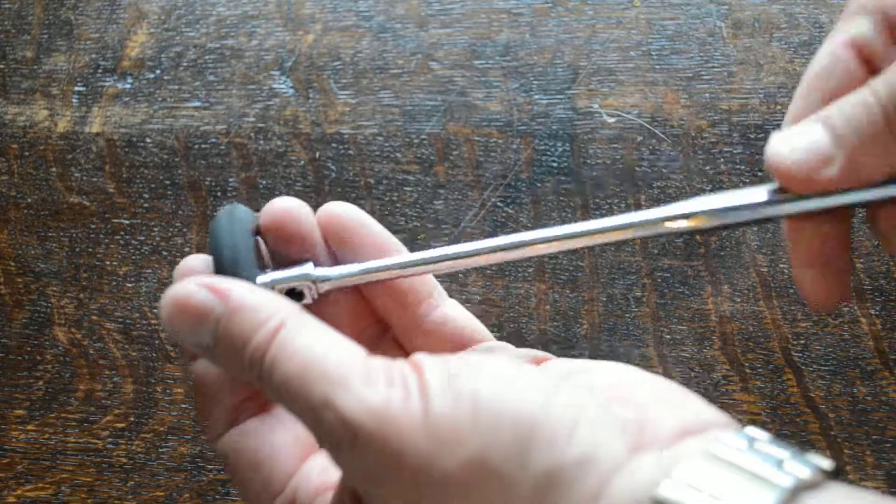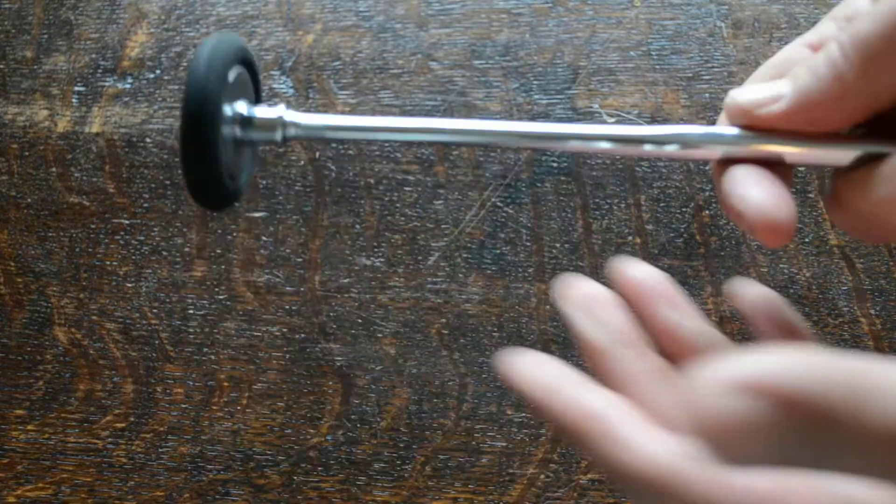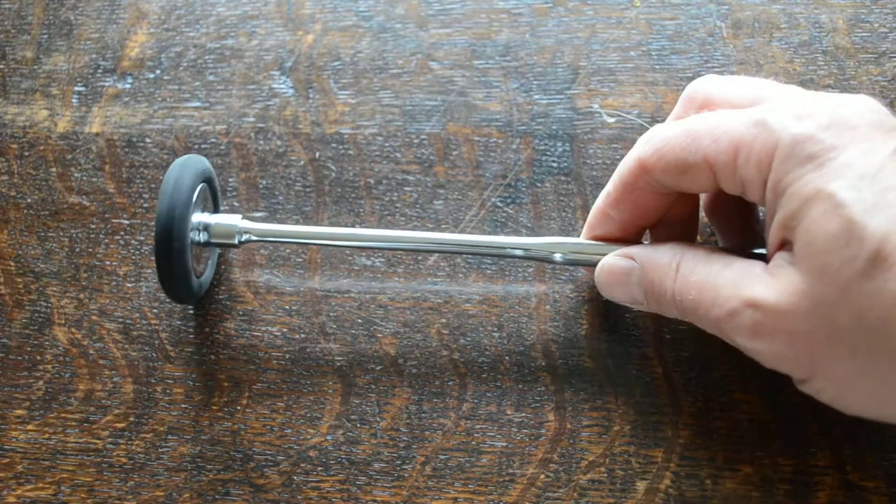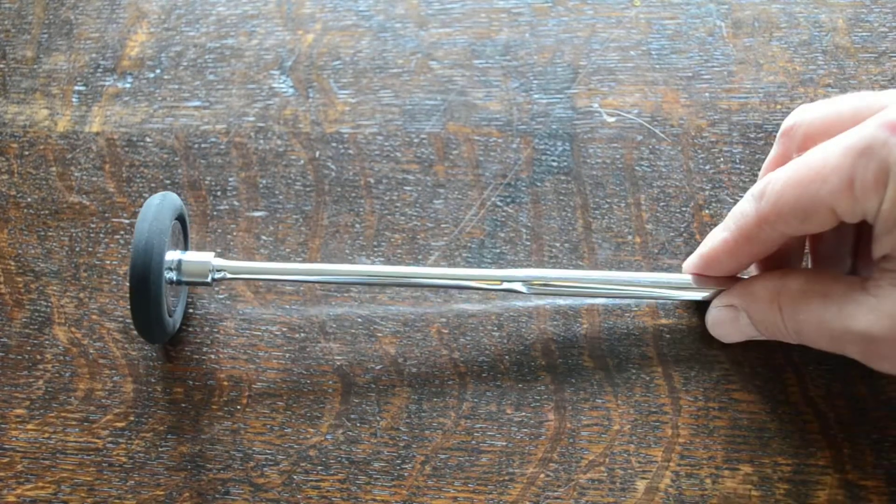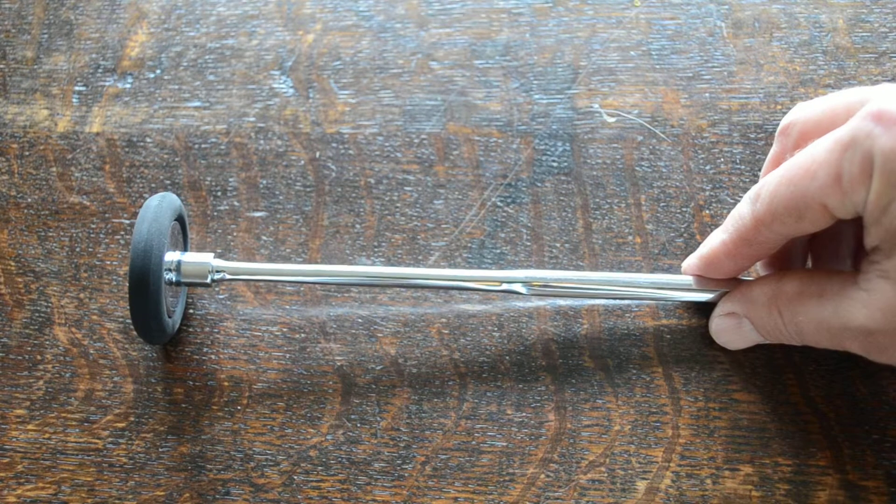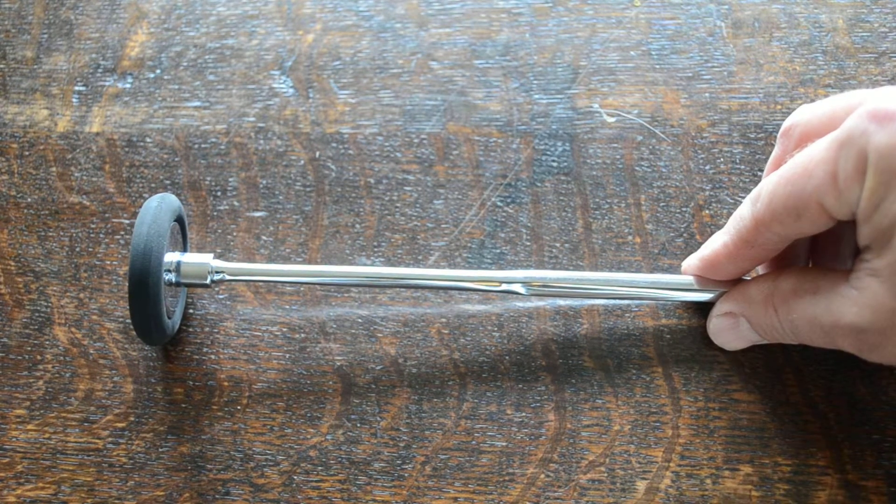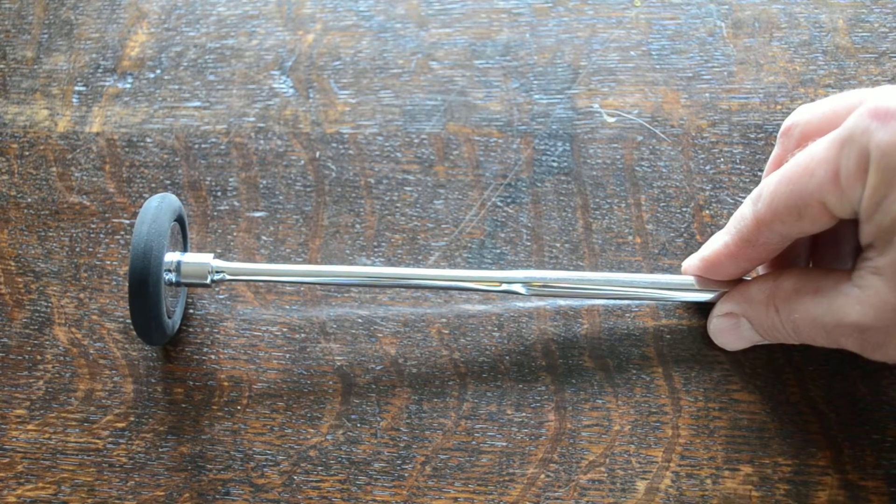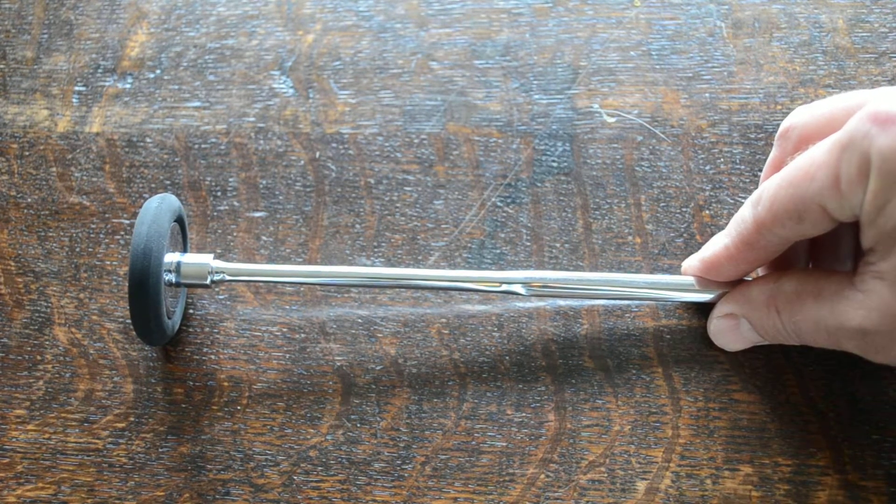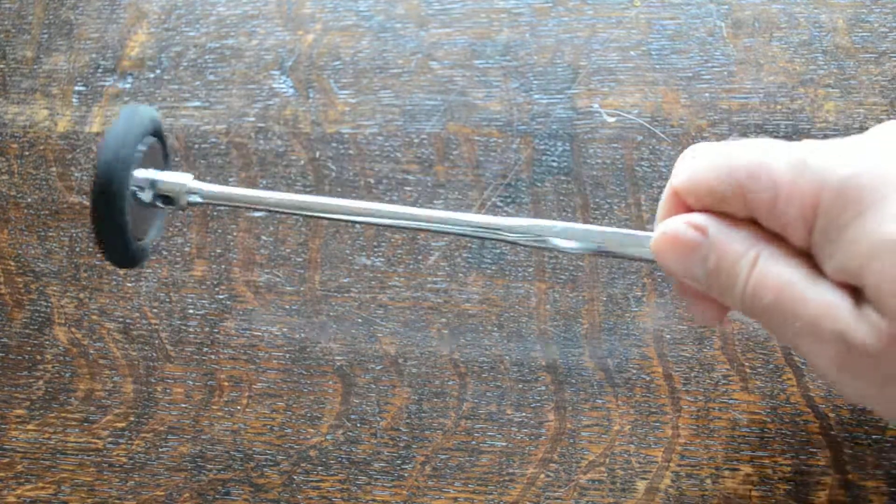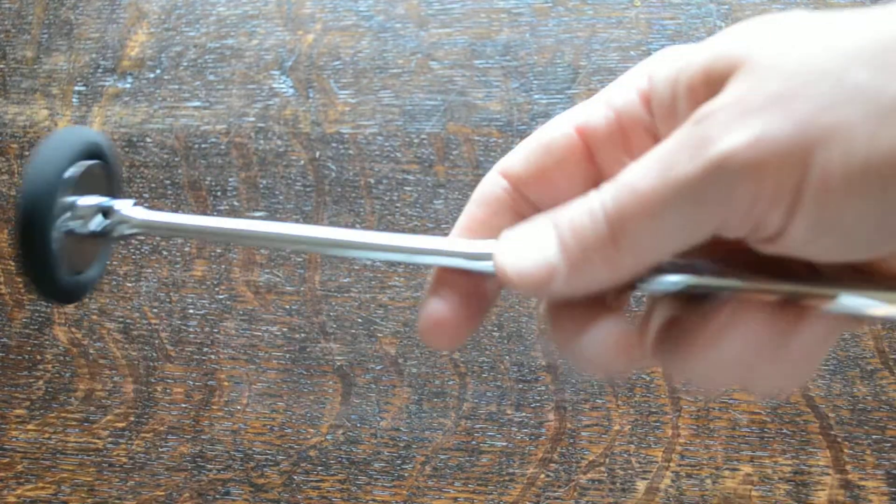It all locks in very tightly. The screw fitting on this is good quality. Some of these units used to be quite flimsy and you couldn't really attach them tight or they would not give you a good lock. This one is really nice and solid.